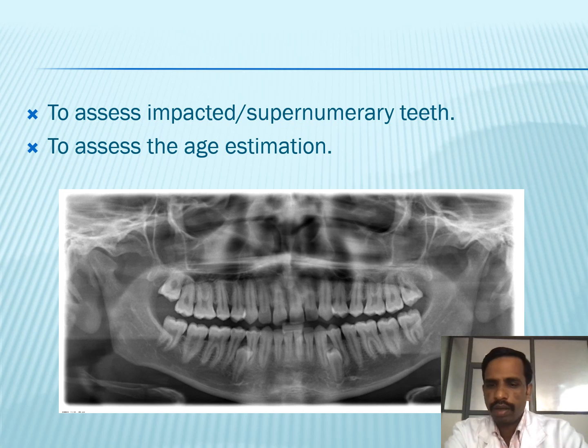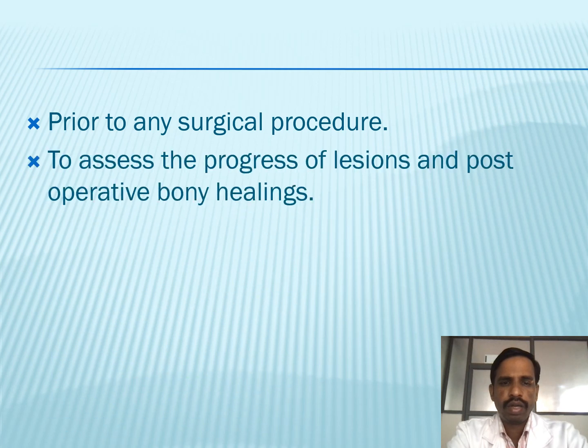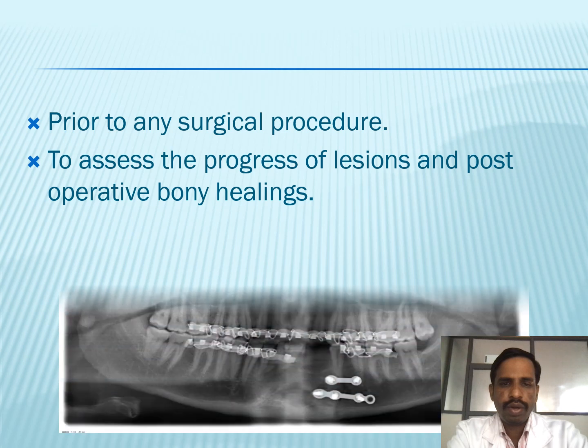It's the most commonly taken radiograph. So in surgery, if you want to assess any impacted teeth or supernumerary teeth, you need to go for OPG. Even if you are doing any surgery, before doing it you need to take it and check the lesions. And if you want to compare pre and post operative sites, you need to go for OPG.